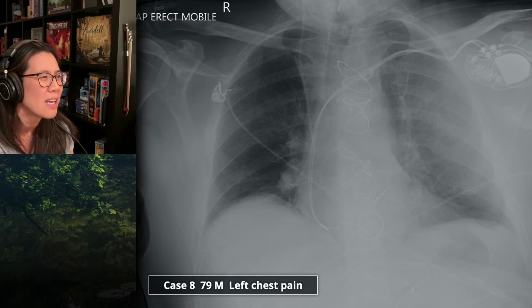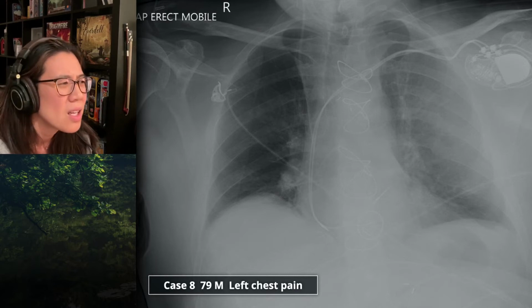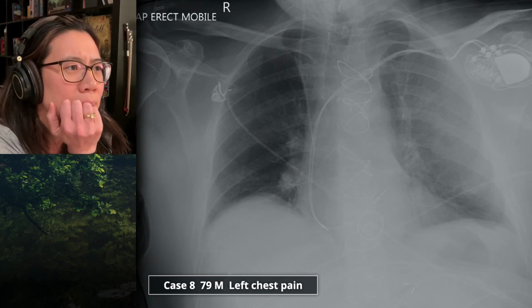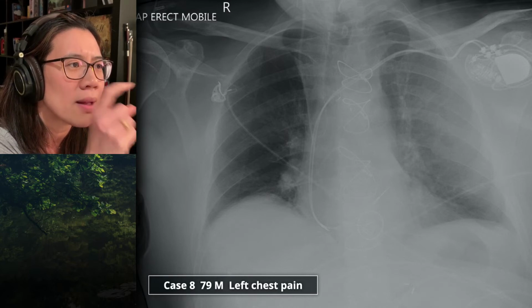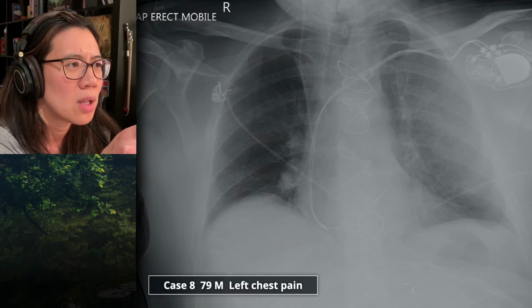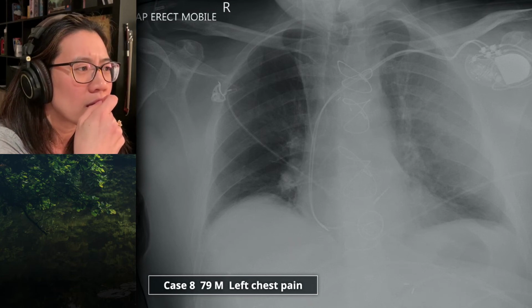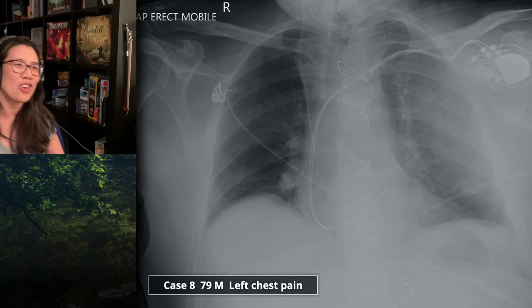Have people been intervening on this patient? Has someone done something to this patient recently? That's my first question. Why are you asking that? Because, I don't know if I'm making it up, but above the coracoid process of the left scapula, I think there are what look like at least 2 large lucencies. That's a good observation. Is that a pacemaker inserted? Oh, the pacemaker's new. 3 days ago. Oh, the pacemaker's new.